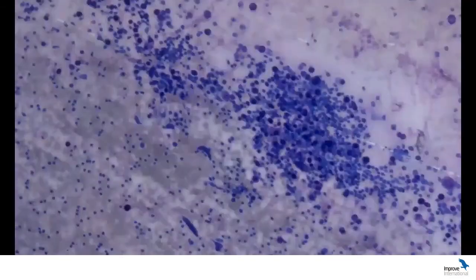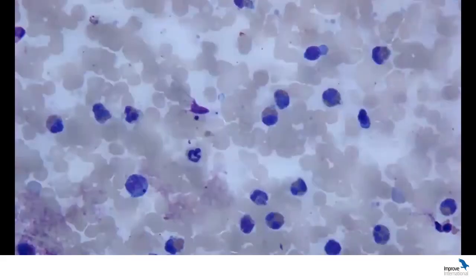So when we looked at that initial area of the smears with a higher magnification, we would have been able to identify that a lot of it was blood. So we had lots of red blood cells and platelets as well scattered. And then we had lots of cells that were in a concentration that was maybe greater than what we would have expected from a normal peripheral blood smear.